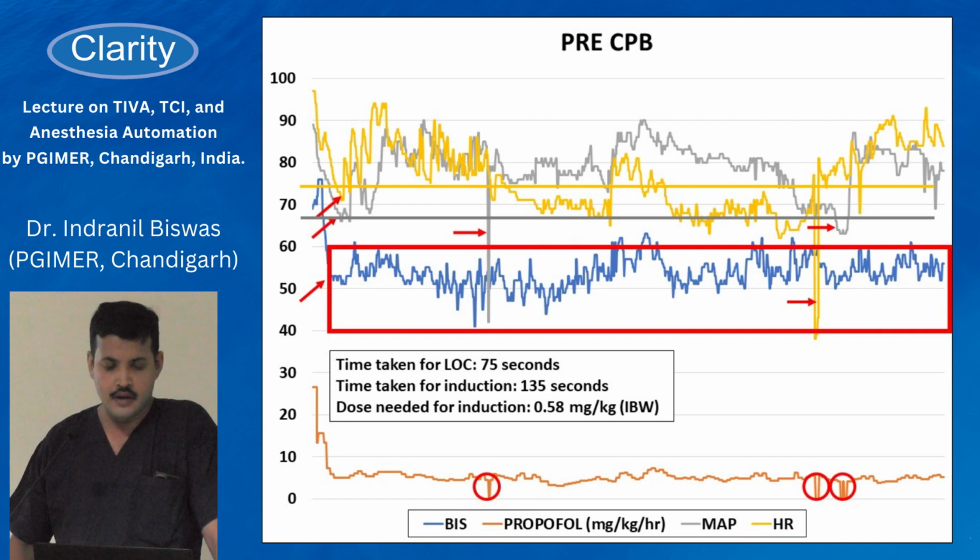And this is the 25% line of the baseline. So you can see in most of the times the mean arterial pressure was maintained above the 25% less than that of the baseline. Now this is the lowest heart rate that we achieved during the induction, and after that it maintained fairly well above the less than 25% from the baseline.